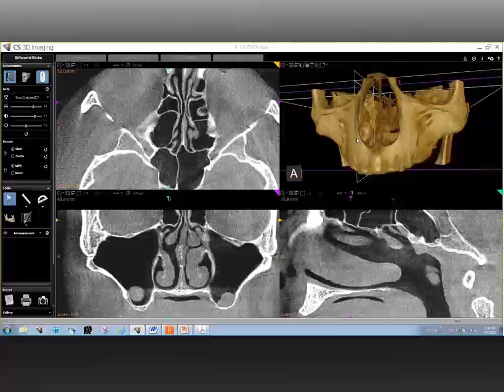Okay. Well, let me get back to what we were on. That was an interesting aside, and I do think it's important to point out not just the benefits of cone beam CT, but, as we have mentioned here, some of the limitations. But let's go back to the subject, and let me ask you another question. What are the most important landmarks to be considered while planning for implant surgery in the maxillary jaw?